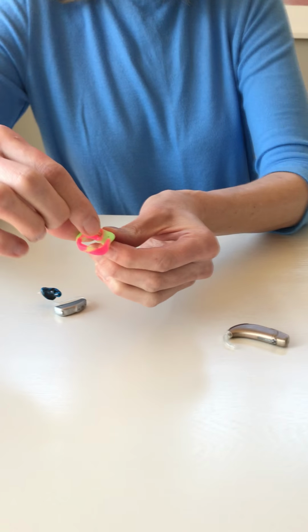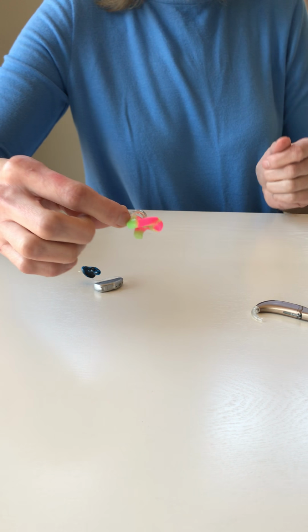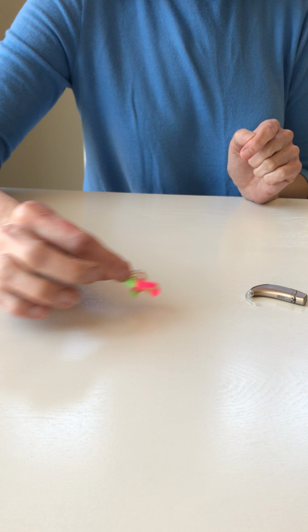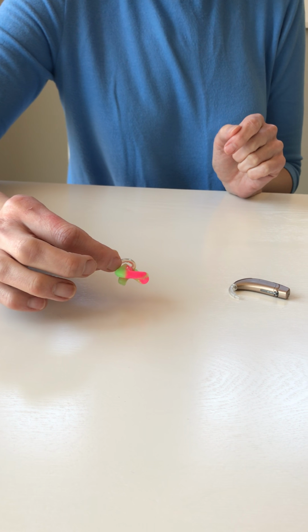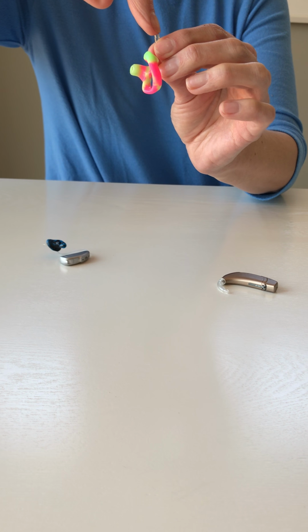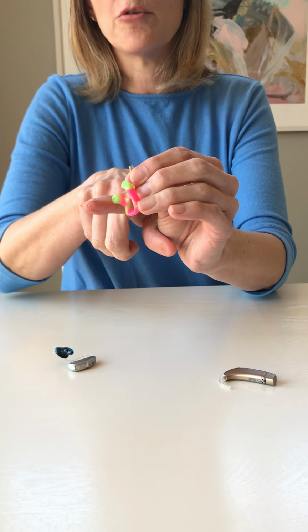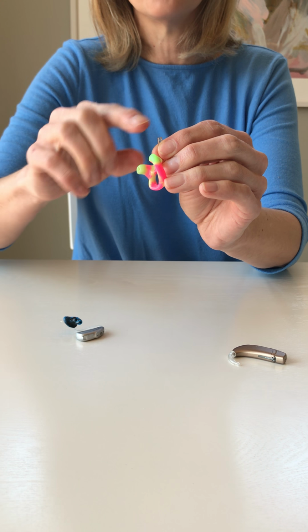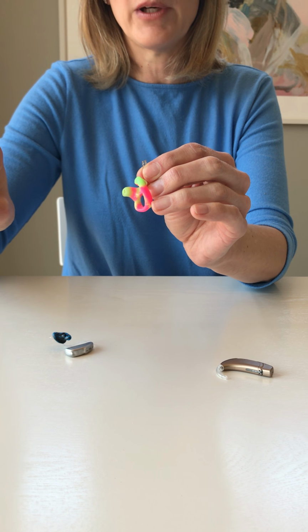If I don't see a tear or a hole, then I'm going to put this in some warm soapy water with hand soap. I'm going to rinse it for a little bit. I'm going to clean it out. And then I'm going to hold it back up under the faucet so that water pours into the top, and I'm going to wait for water to then shoot out so I know water is traveling through the whole tube, and that I have a nice clear pathway again.